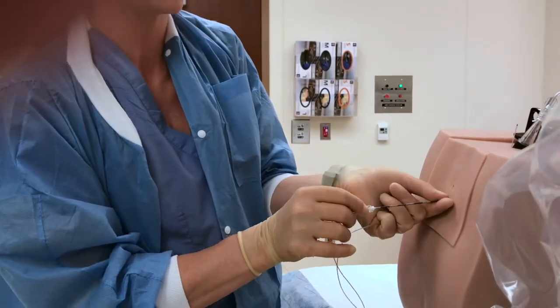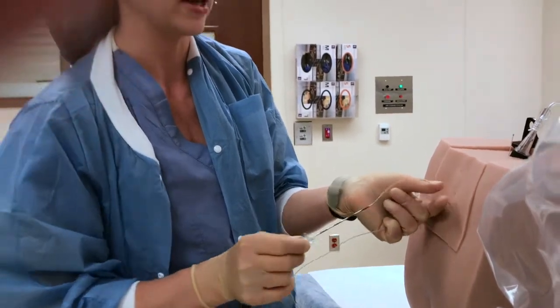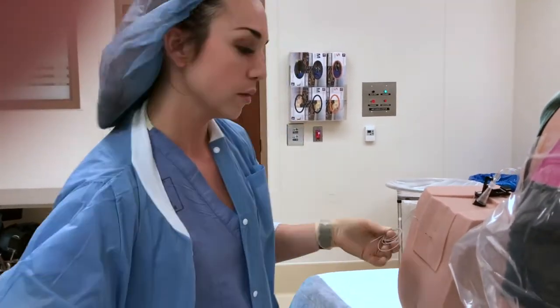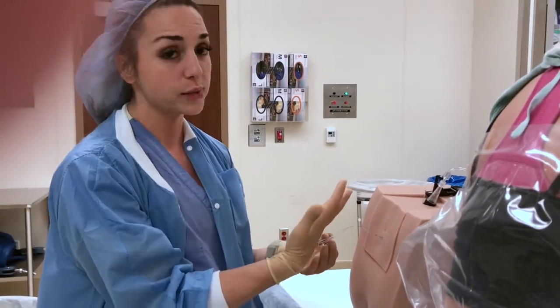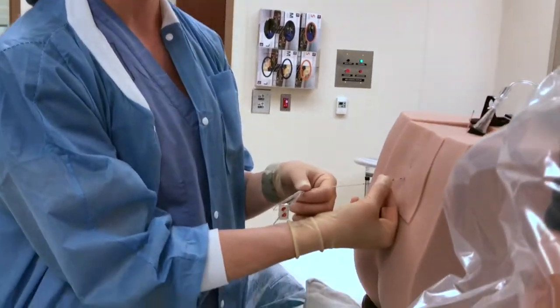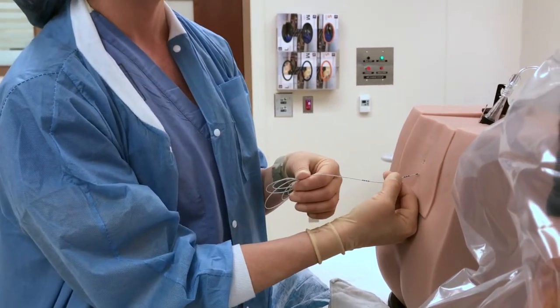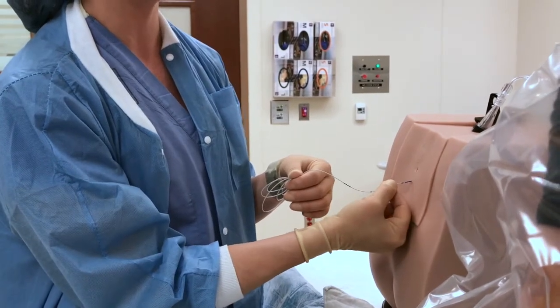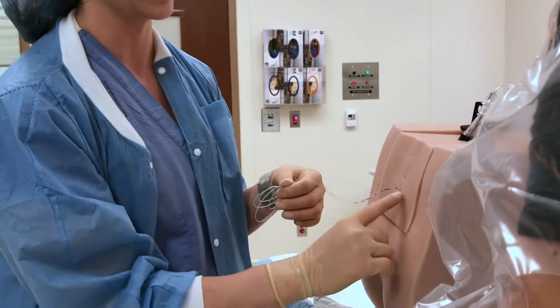And then right when I see the tip, I usually just secure the catheter, hold it here at the back to make sure that you don't pull it out further. Once it feels secure, you can gather the slack. And then this is where we're going to pull out the catheter to the correct spot. Remember, our loss was at 5, add 5 to that, so we're going to go to 10. So this is 20. We should see 15 coming up right here, so 5 times 3, 15. 13, and then this big thick line is 12. 11, and so the next one should be 10. So I'm just going to leave it right there at 10.